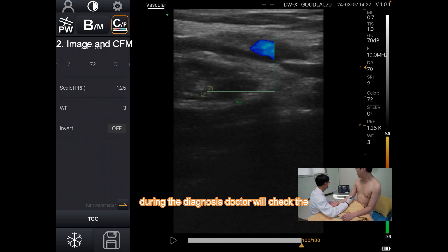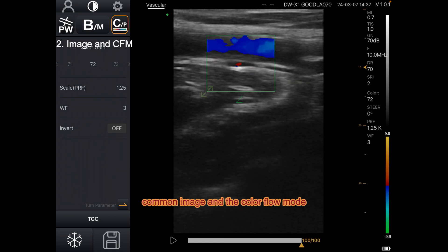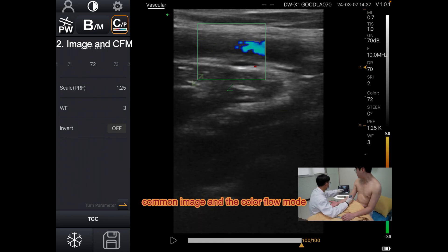Well first, during the diagnosis, the doctor will check the common image and the color flow mode. See here.